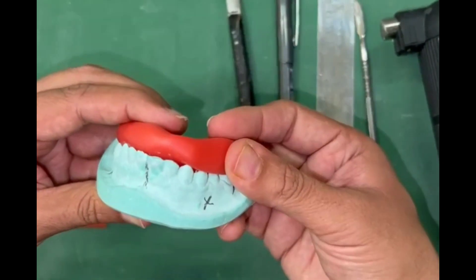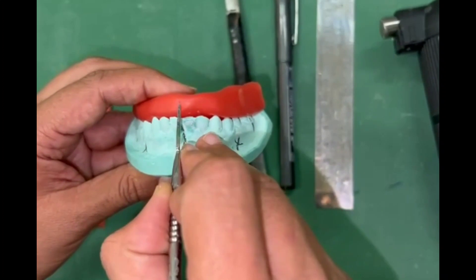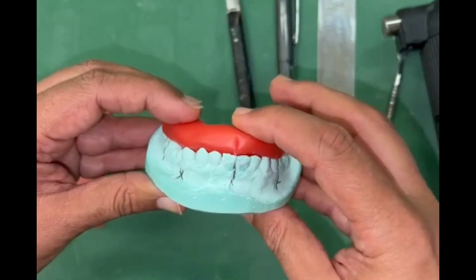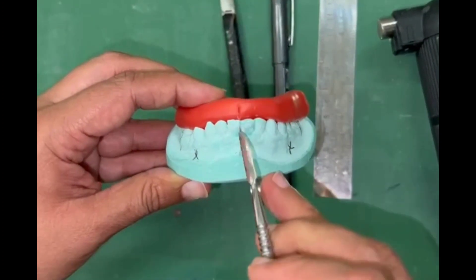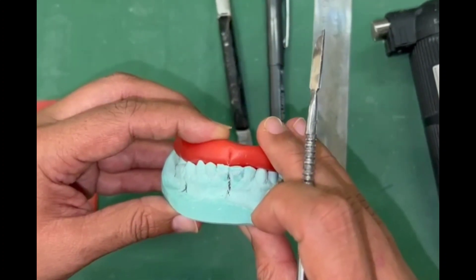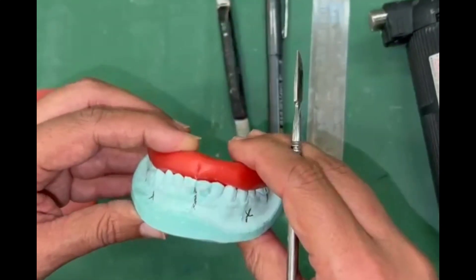Mark the midline like this. It is important to keep the wax sheet on the lingual aspect of the lower incisors so that once you place this wax sheet in the patient's mouth, you can clearly see the lower midline and where they are occluding.